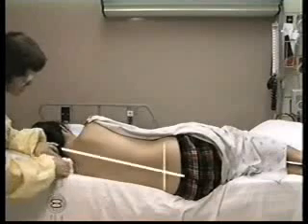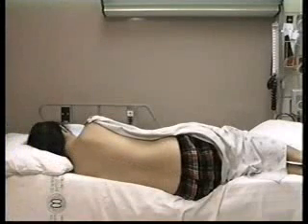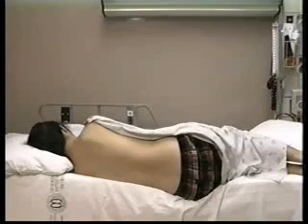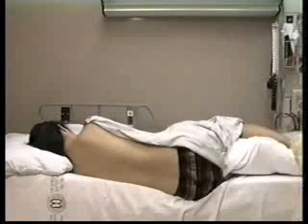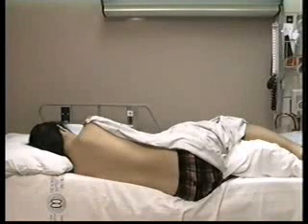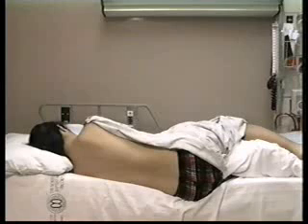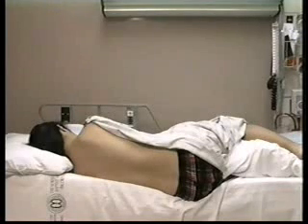Flexion of the neck is not of great value here to heighten the interspace. Pillows can be placed between the knees to assist in keeping the iliac crests aligned. Double-check to make sure you have everything you need. Have the patient draw his or her knees up to the chest to widen the spaces between the spinous processes.